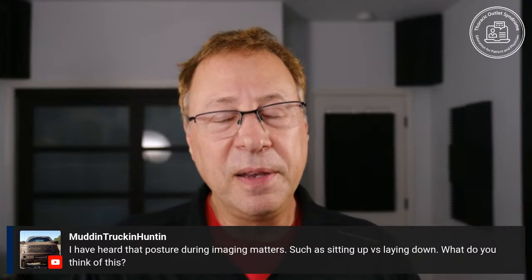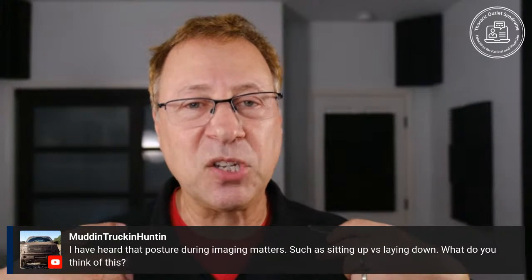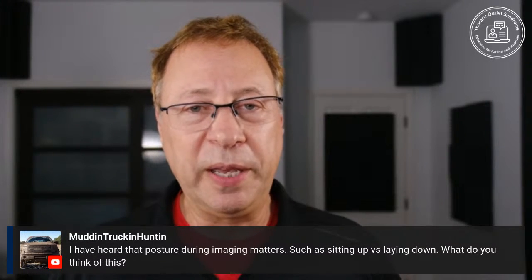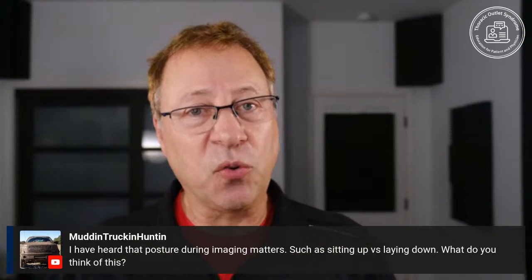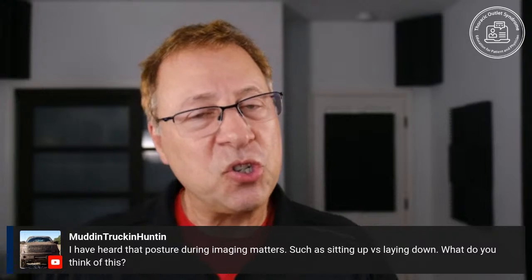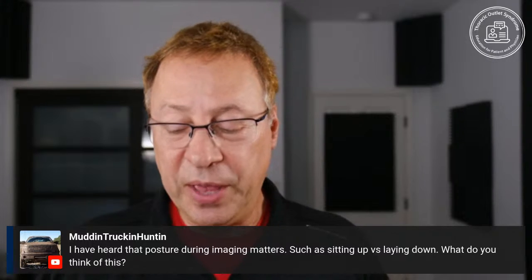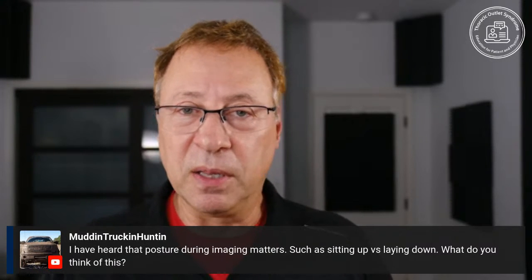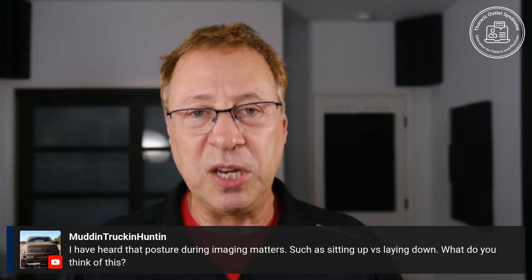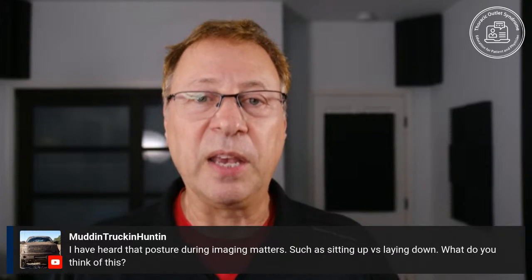I think it should be easy to imagine that the weight of the shoulders when you're laying flat on an MRI table or a CAT scan table is very minimal. But when you stand up and you've got the weight of the shoulders and the arms pulling things down, including the collarbone, you would increase that amount of compression. So whatever we see on MRI, I assume in normal life where a patient is sitting or standing, that compression is actually going to be worse. We're thinking of doing a study to try to prove this, but the question is excellent. I think it's been proven on previous arteriograms. Of course, they couldn't see the brachial plexus with the technology at the time, but I think it's absolutely true. Thank you for the good question.